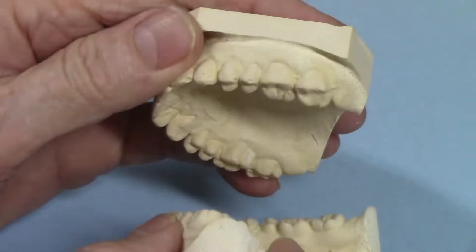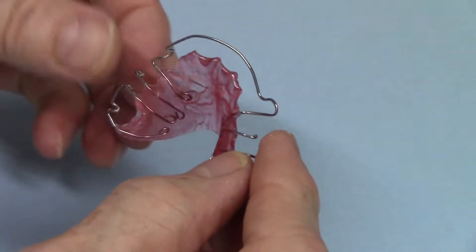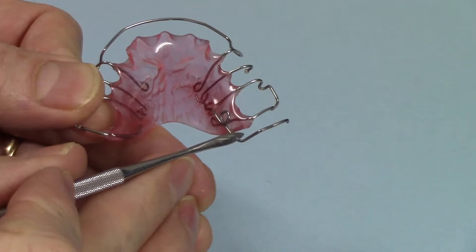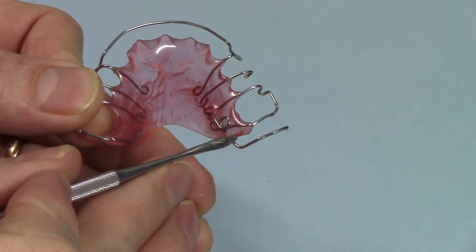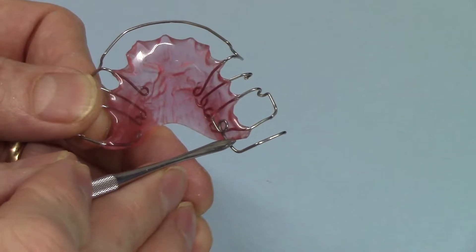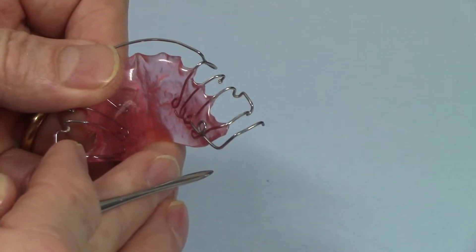They wanted a removable appliance, so what I came up with was a modified retainer with a spring. This is the 032 beta-3 titanium wire — I wanted it to be nice and strong yet resilient. It needed some good resiliency because this is a removable appliance; I didn't want the spring to be so strong that it would dislodge the appliance.